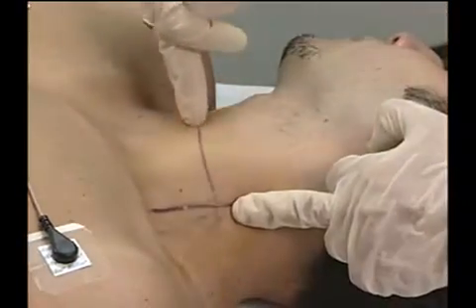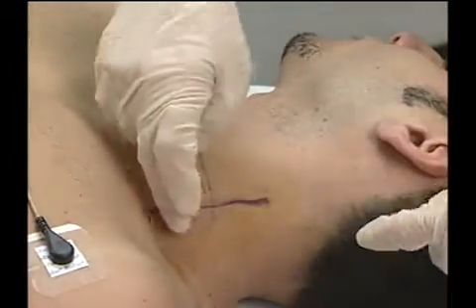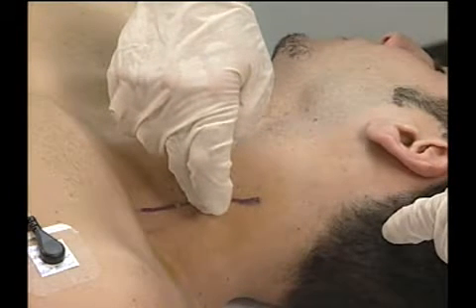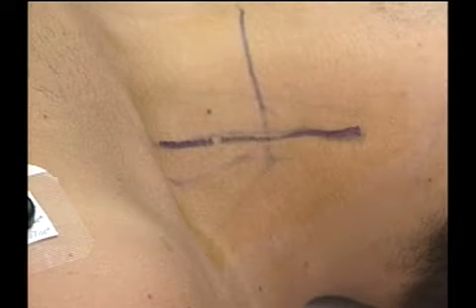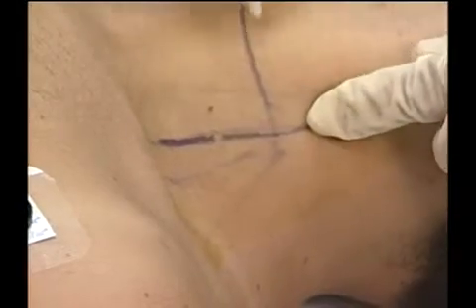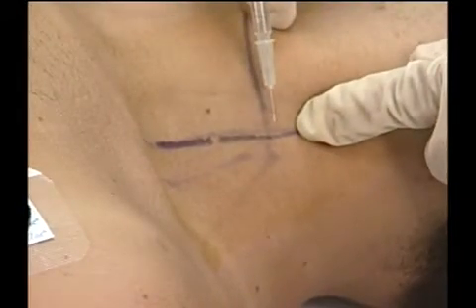Next, a horizontal line is drawn at the level of the cricoid cartilage. The intersection of these two lines represents the site of the introduction of the needle. Next, local anesthesia of the skin with 1 to 2 cc's of 1% lidocaine is performed by introducing the needle subcutaneously.